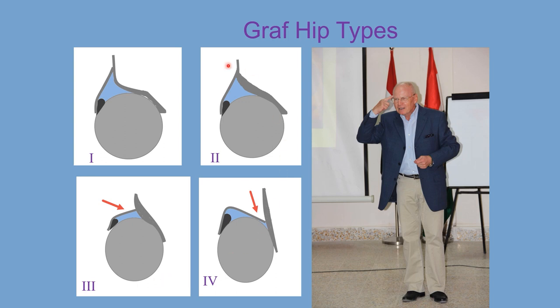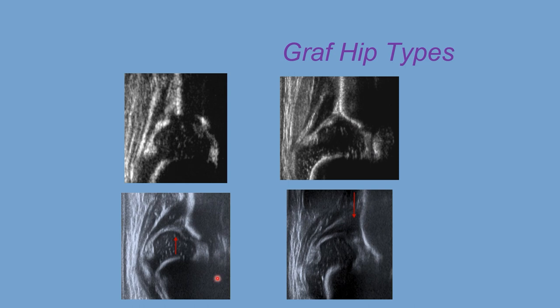Reviewing images of all four types: Type 1 — centered, more than 50% inside the bony roof. Identifying the chondro-osseous border, femoral head, synovial fold, capsule, labrum, cartilaginous roof, bony roof, lower limb, turning point with good acoustic shadow, and straight iliac plane. The turning point is above the labrum, and drawing a line from it shows most of the hip inside the bony roof.